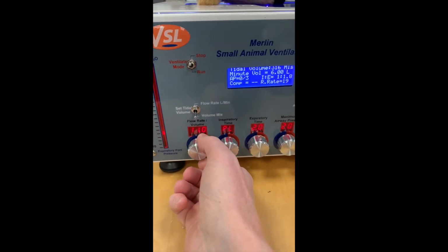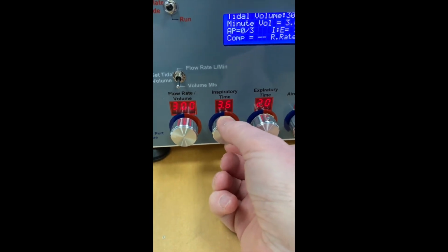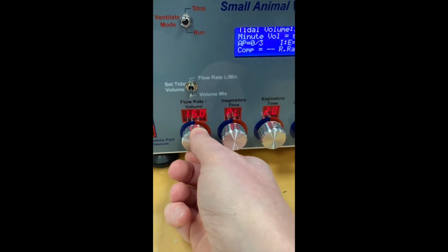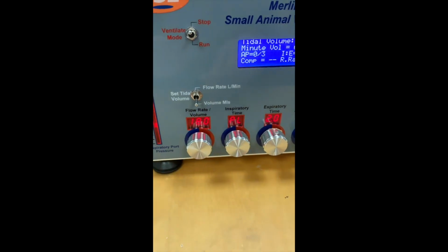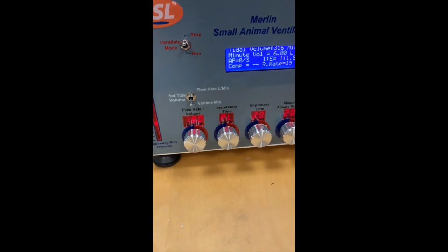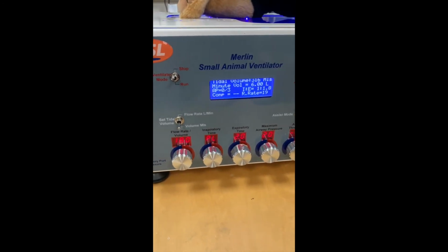The knob you probably saw on the left here was saying mils, and as soon as we went to pressure cycling mode it changed to flow. So now we've got flow rate for our control. So we'll set this to 18 litres. So we'll be delivering 300 mils in 1 second. So on the basis that 6 litres a minute is 100 mils per second, 18 litres a minute is 300 mils per second. So we should, with these settings, achieve our aim of delivering about 300 mils to our patient. So we put this to run.